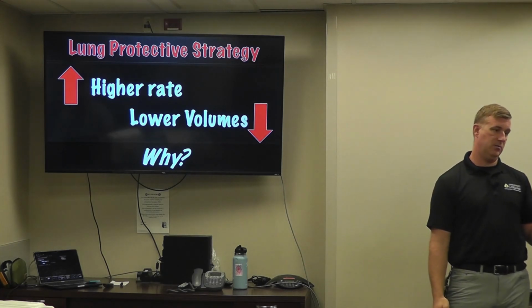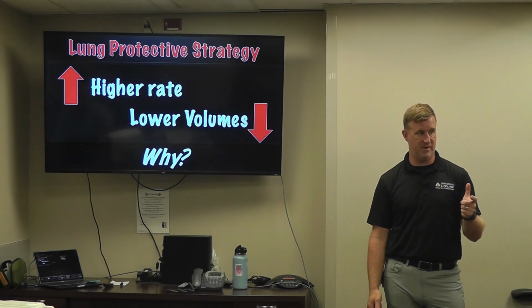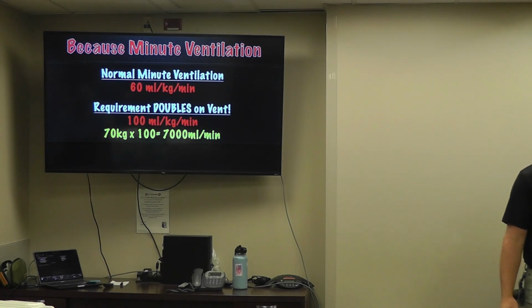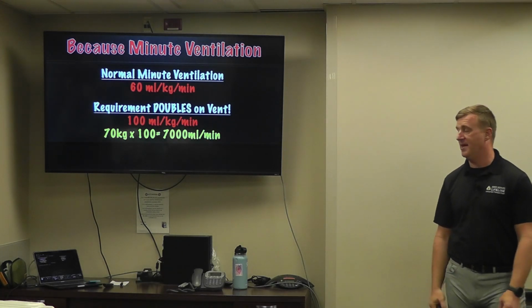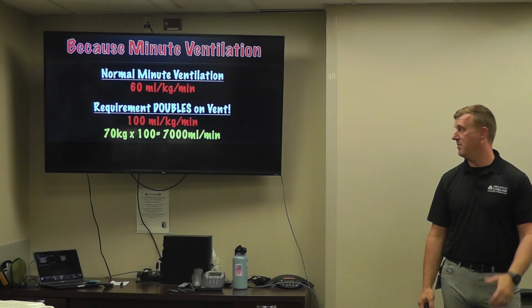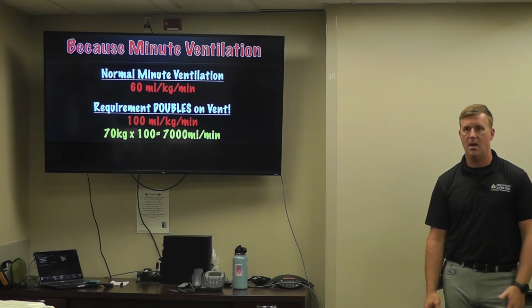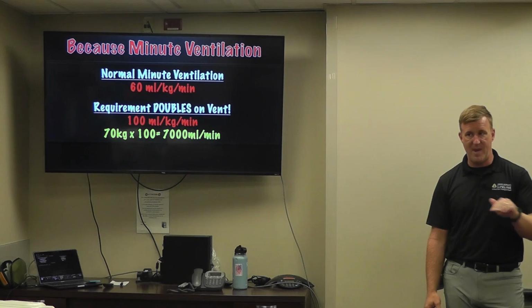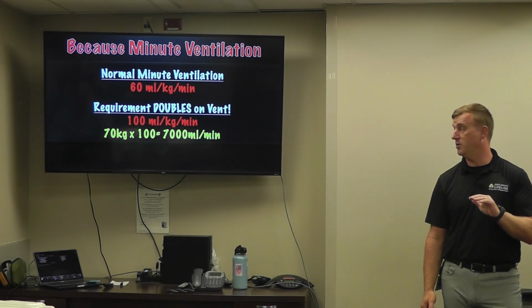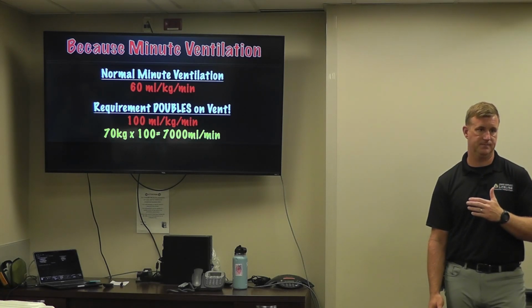And what you're talking about, right? Rate and tidal volume, what do those two together make? Anybody know? Minute volume, minute ventilation. So the reason for that is we have to maintain an appropriate minute ventilation. All of you guys in this room are pulling about 60 mLs per kilo ideal body weight, okay? I'm, of course, doing more because I'm up here running my YAP, but as soon as I intubate you, it roughly doubles to 100 to 120 mLs per kilo ideal body weight. So a patient's baseline metabolic demand is going to require 100 mLs per kilo per minute to clear their CO2 and keep them eucapnic, okay?